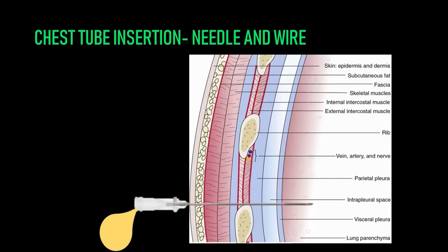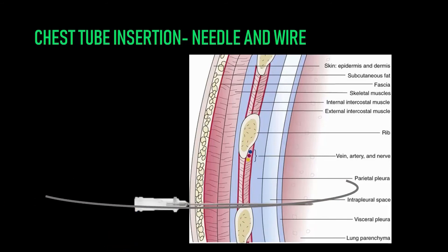Recheck that you have free drainage of pleural fluid. Now carefully stabilize the needle and advance the guide wire into the pleural space — you should not feel any resistance. The wire is likely to hit either a mediastinal structure, the diaphragm, or a piece of lung, at which point you'll feel a bit of resistance and should stop advancing. You can then withdraw the needle, leaving the wire in situ. If you're using a kit with a syringe, such as the Thalquik, make a little nick at the skin site along the wire.